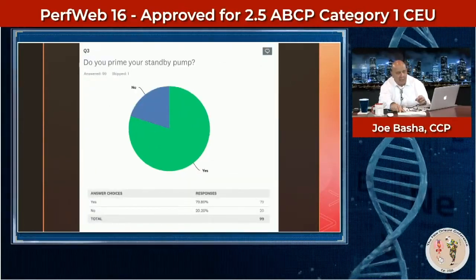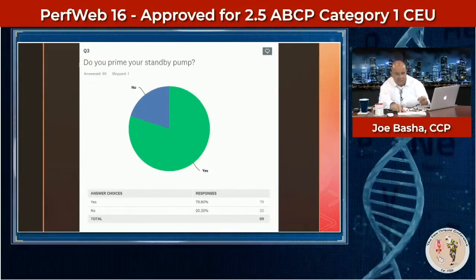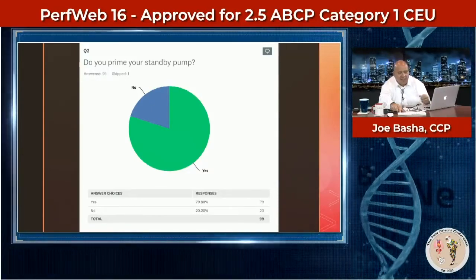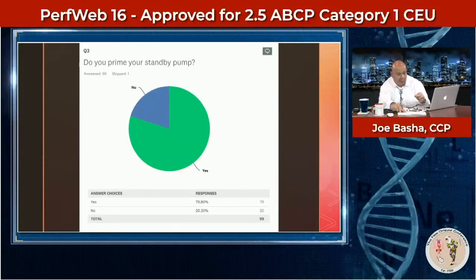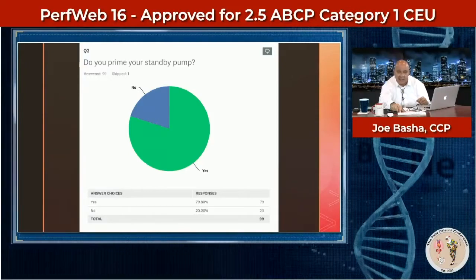Do you prime your pump? Of the respondents, there were 99 respondents, so somebody didn't respond to this one. 79, almost 80%, responded that they in fact do prime their pump. And in this study, 20% said that they did not.